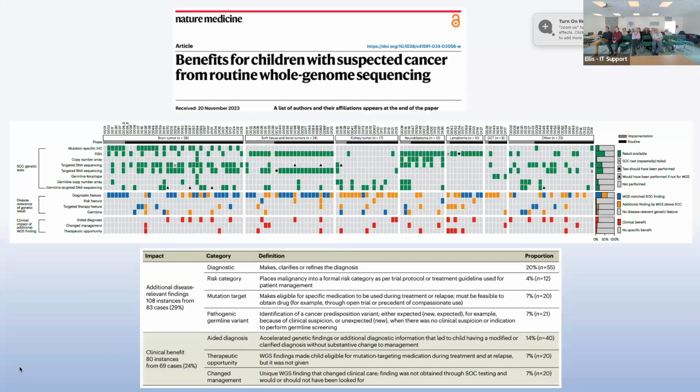And so you may recall people talking about the 100,000 genome project. So again, sort of back in the day, where the aim was to sequence 100,000 genomes, germline and somatic. But when these came out as pilot studies, I think because of local expertise, we jumped on the opportunity to put our clinical cases through it. So we've got a few different areas that we were able to produce our data.